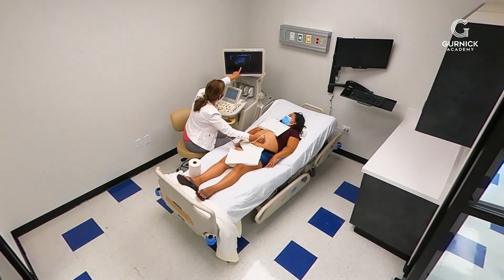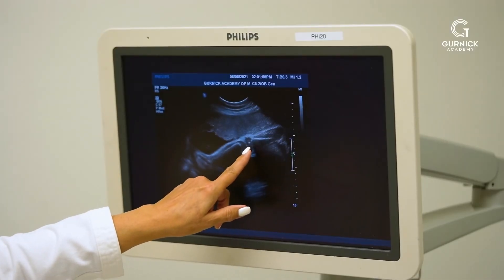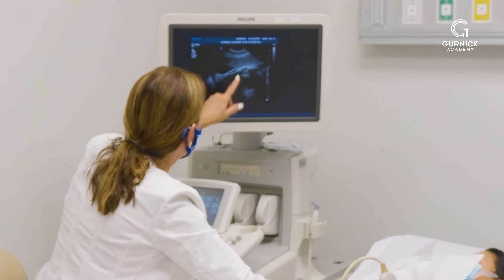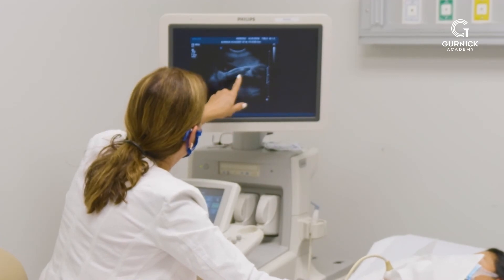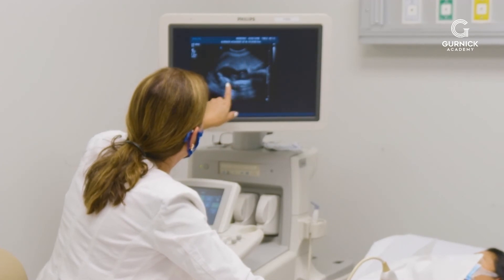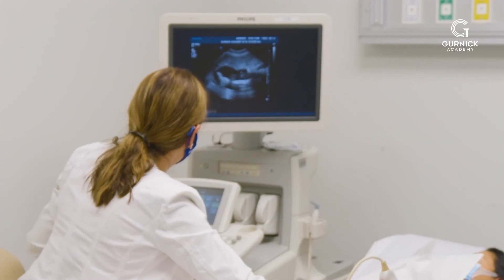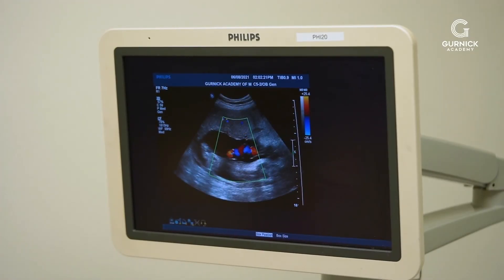There's one whole leg — that's the femur. Here's the knee. See that little dot? That's an ossification, which actually helps us with dates and means you're 34 weeks or more. Here is the lower leg and the feet, and here's the other leg, so they're together. All this bubbly stuff is the umbilical cord, and I can put color on it so you can see the blood flowing between you and the baby.